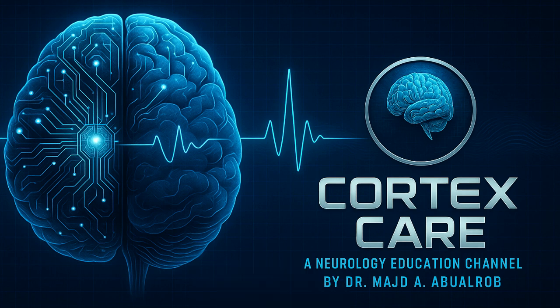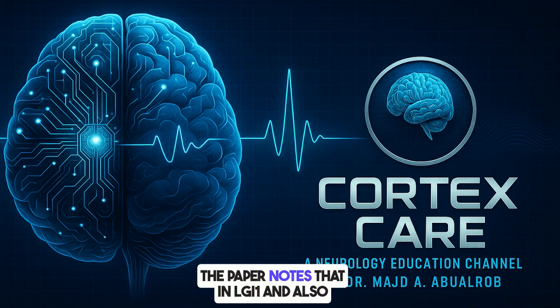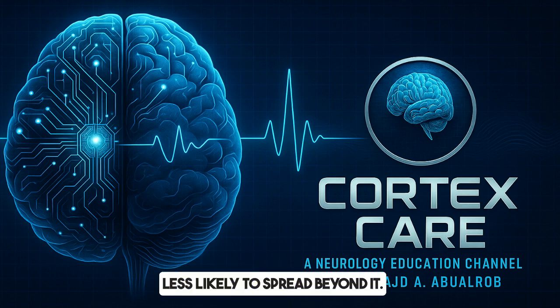Huh. How do these LGI1 changes compare to other things that affect the temporal lobes, like viral encephalitis? Good question. The paper notes that in LGI1 and also CASPR2 encephalitis, these medial temporal lobe hyperintensities tend to stay more within the temporal lobe. Okay. Less likely to spread beyond it, less swelling, less diffusion restriction, that sign of active cell injury, and less contrast enhancement compared to something like herpes encephalitis or CJD. So that can be a helpful clue.